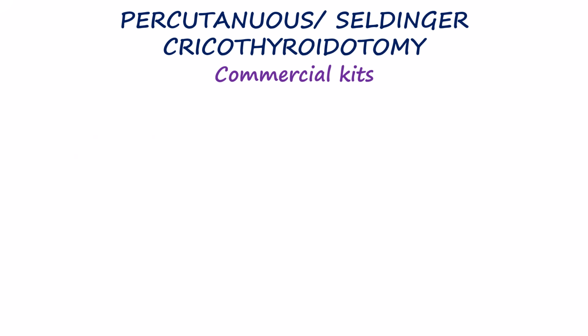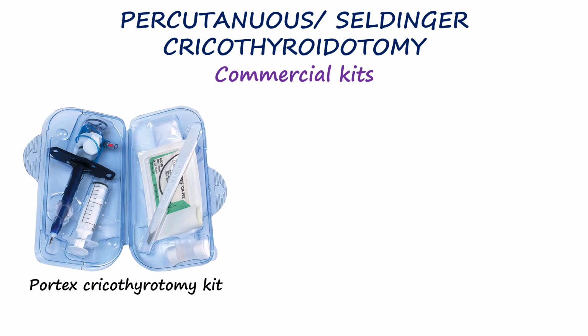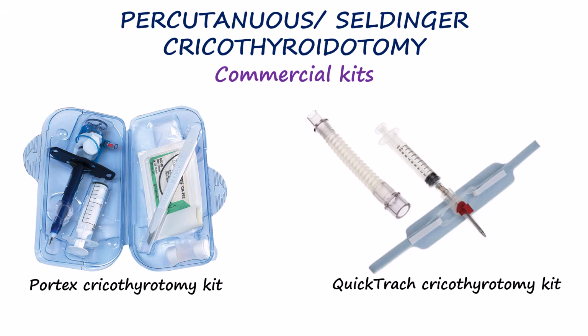Commercial kits are also available for percutaneous cricothyrotomy using the Seldinger technique, providing all essential components in a single ready-to-use set. Some kits, like QuickTrach, do not use a guide wire or scalpel. Instead, a needle cannula unit is inserted directly through the cricothyroid membrane.